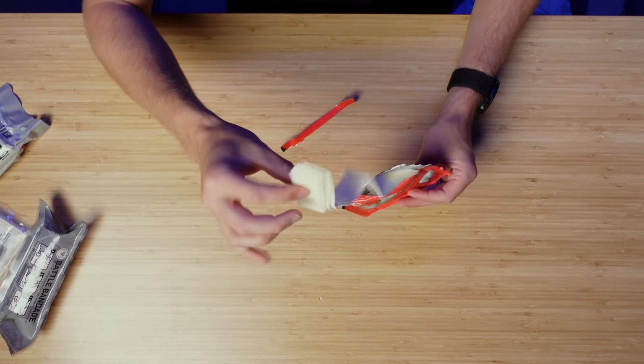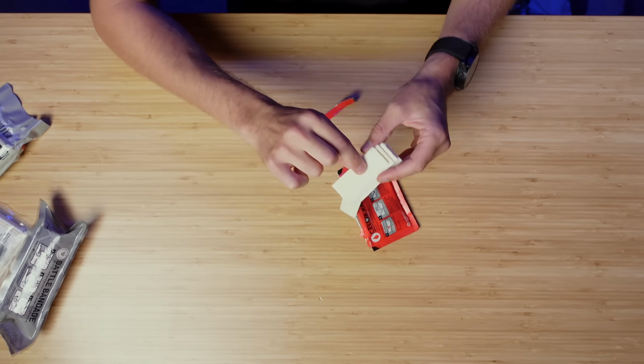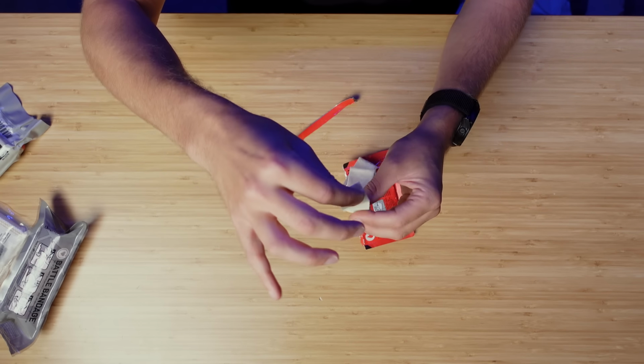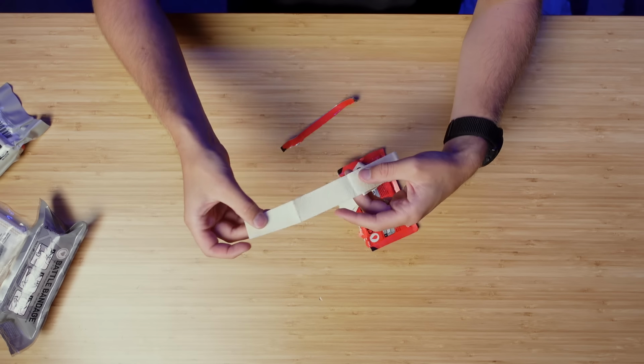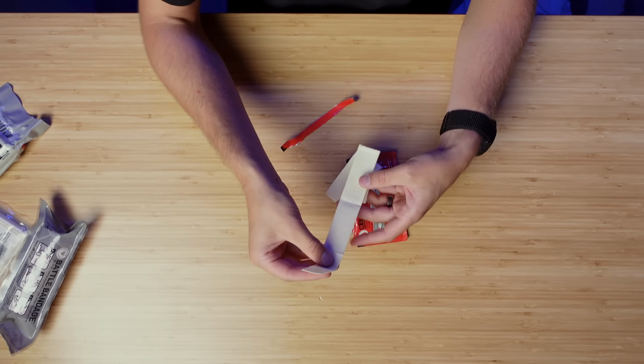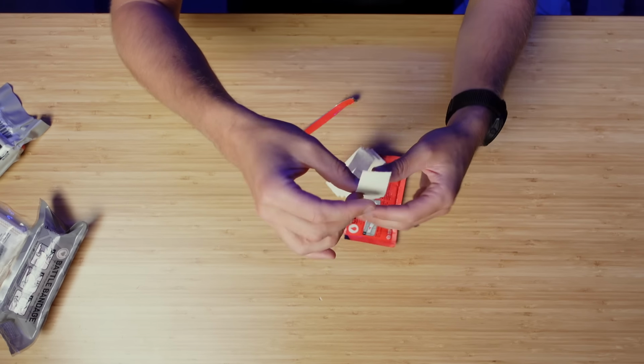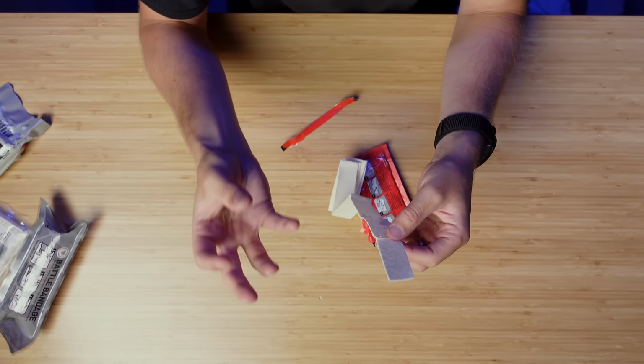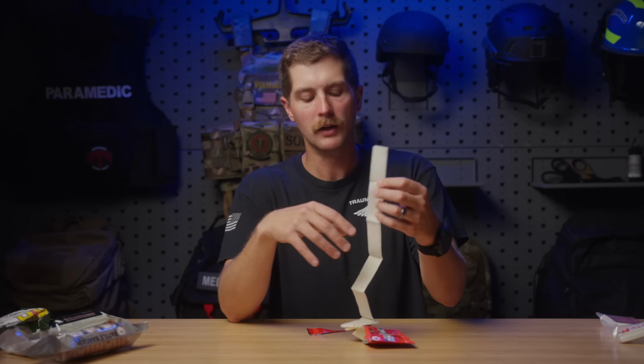Now, this is the small version. I wouldn't use this if I were you. I'd use the bigger version they have, but it's the same thing. So here we have this, and it almost has like a cornmeal on it, and this gauze, when it's packed into the wound, actually will form kind of a gelatinous clot in there. It will form like this gelatinous ball.